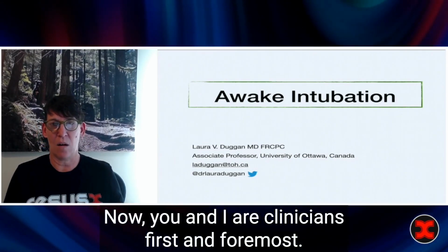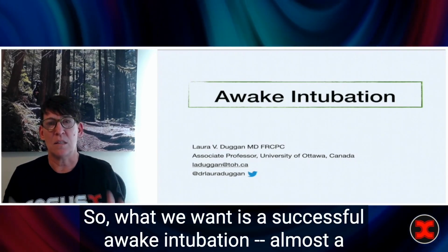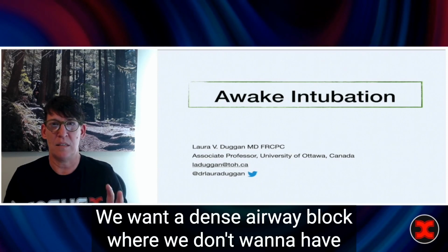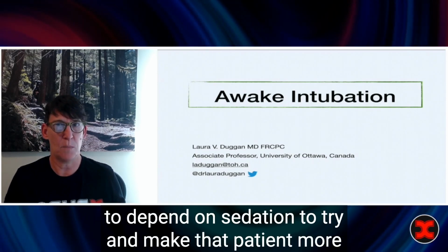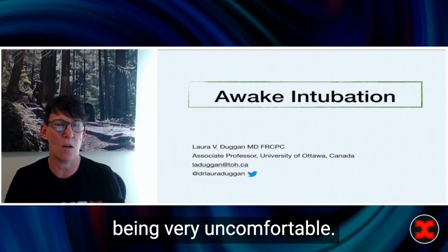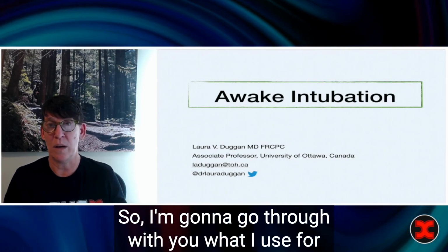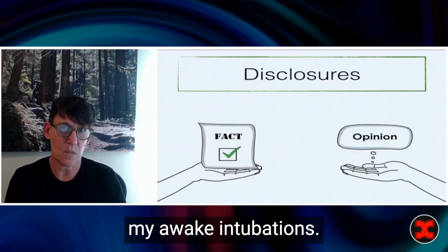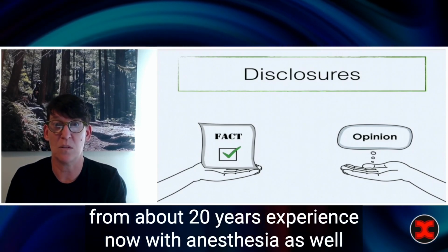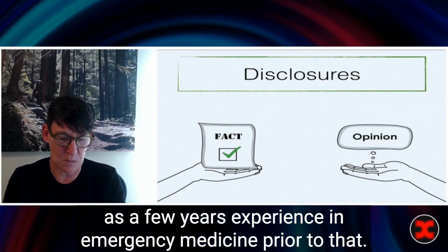Now, you and I are clinicians first and foremost. So what we want is a successful awake intubation almost 100% of the time. We want a dense airway block where we don't have to depend on sedation to try and make that patient more compliant because they're gagging and coughing and being very uncomfortable. So I'm going to go through with you what I use for my awake intubations. Again, a lot of this will be distilled down from the facts and from about 20 years of experience now with anesthesia, as well as a few years of experience in emergency medicine prior to that.